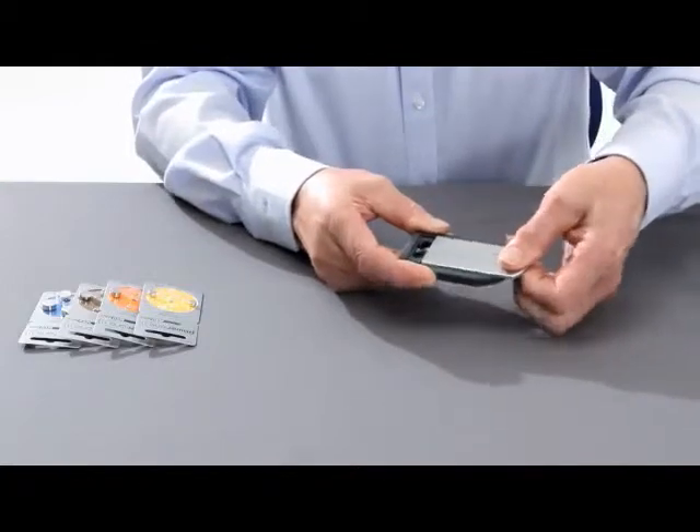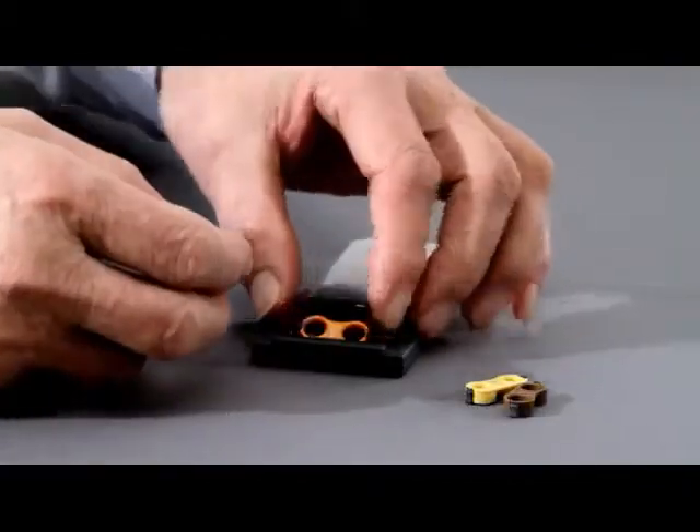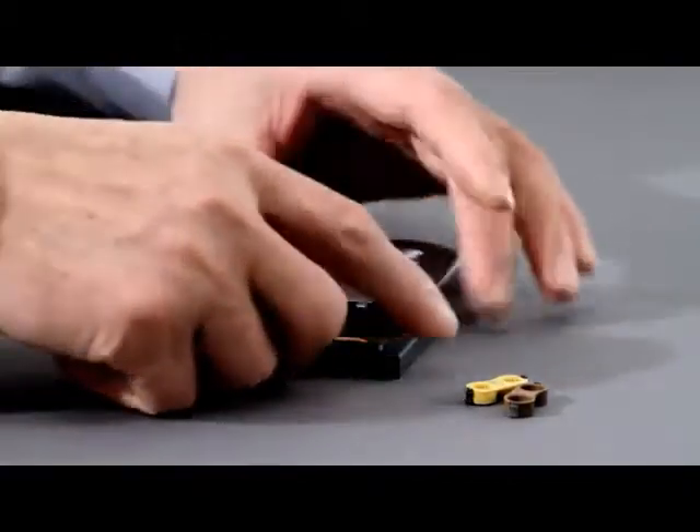First, push back the slide. After you have bought the unit, you only need to use the appropriate battery adapter once for the battery you require.